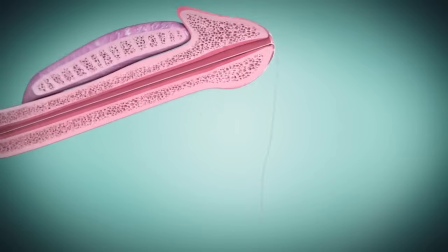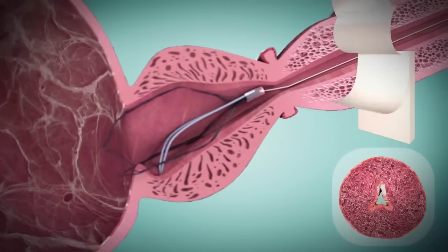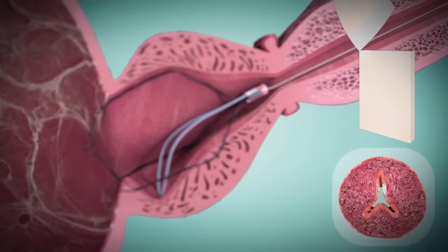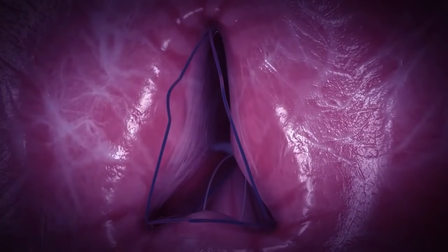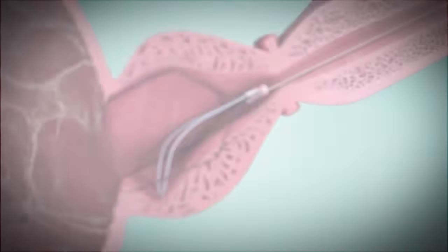During this time, the 3 cutting struts of the ITIND device expand and exert pressure on the prostatic urethra and bladder neck. This gradual and continuous pressure creates 3 deep longitudinal incisions through ischemia and necrosis at 12, 5 and 7 o'clock. After 5-7 days, the ITIND device is removed.